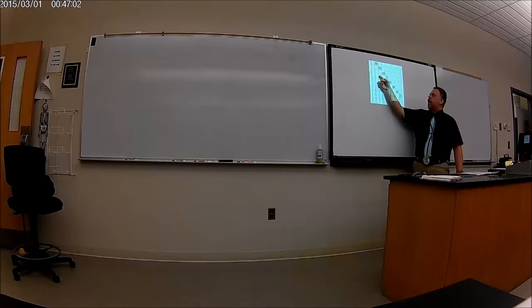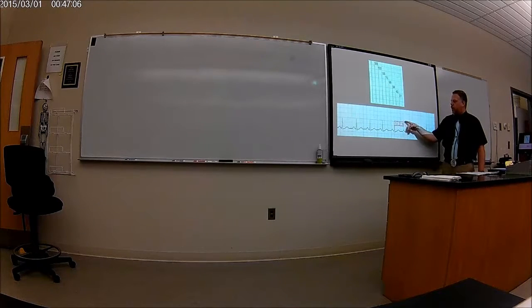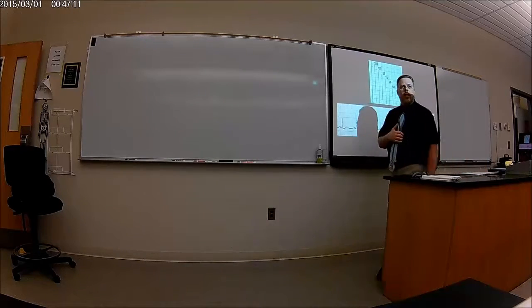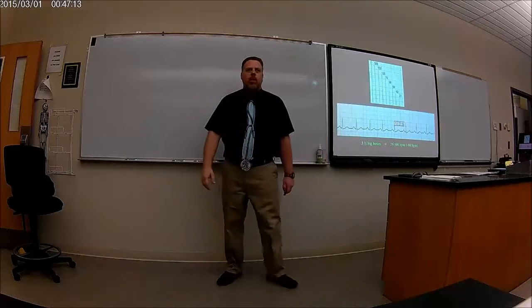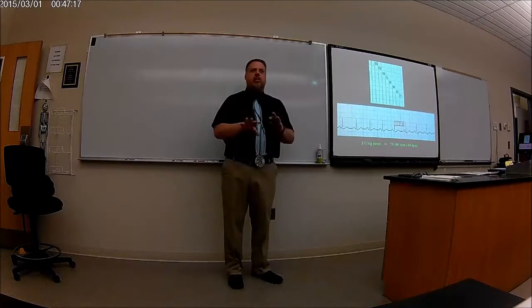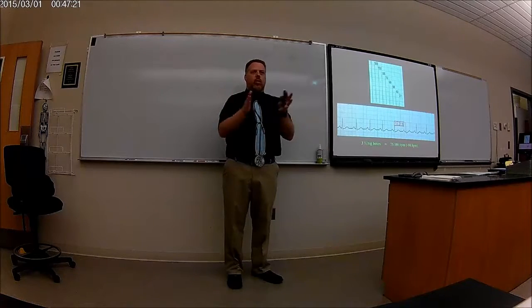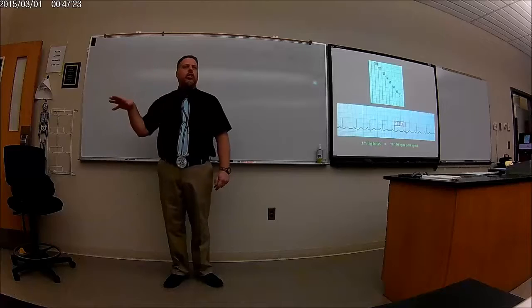So these are the big boxes, how you're doing it. So you'll count it. 1, 2, 3, not quite 4. So this would be about 80 beats per minute. This is if the rhythm is the same. Some people have skip beats and stuff, and you can't do it this way, because then the RR intervals are all different. There's other ways you could do that.